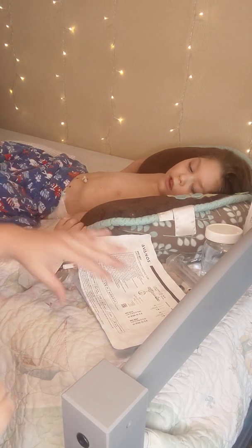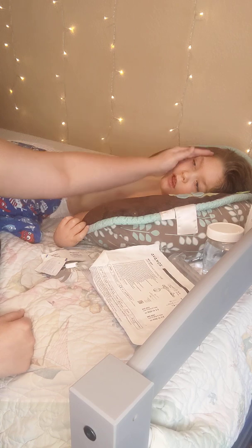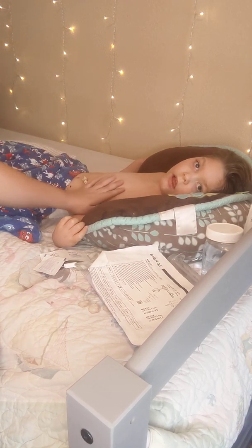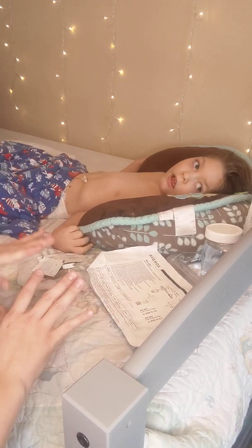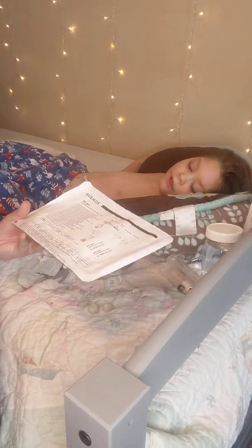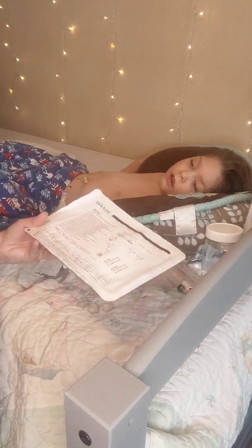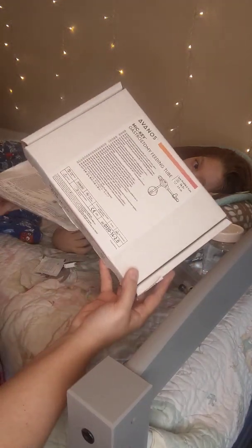Okay, this is going to be a how-to on changing a G-tube button. Our model today is Clay. First, I'm going to show you everything you'll need, or what I use to change this button. It needs to be changed; doctor's orders are every 6 months. I do it myself. I'm pretty comfortable. Sometimes people just take their children back into the doctor. Either way, this works for us.